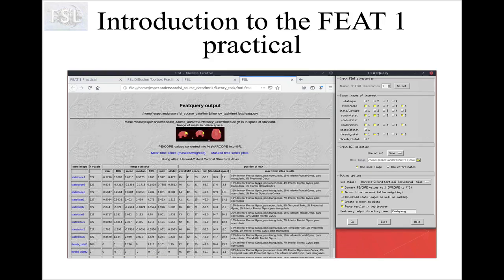Finally, this is what your FEAT query setup should look like, and this is roughly what the output of FEAT query should look like. With that, go ahead and do the practical, and if there are any problems at all, just ask. Thank you very much.